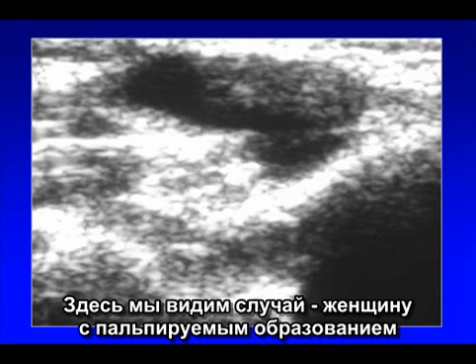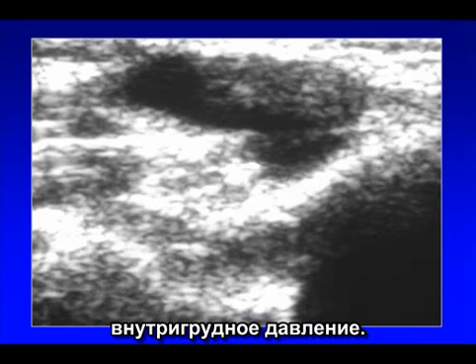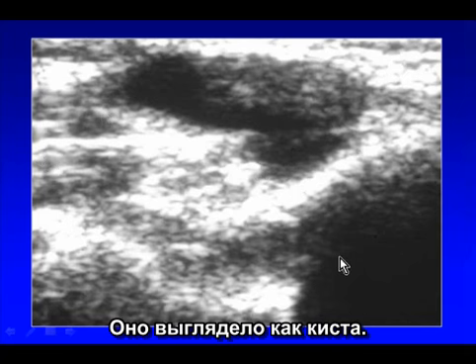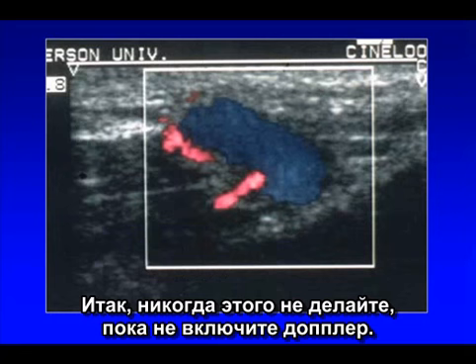Here's a woman who had a palpable mass that was only intermittent in the chest wall, and we had her create the mass, which she was able to do by increasing her intrathoracic pressure. When she did that, this mass popped out, and it looked like a cyst. And of course, the patient says, well, can you drain this for me and make it go away? Well, never do anything like that until you put on the Doppler.